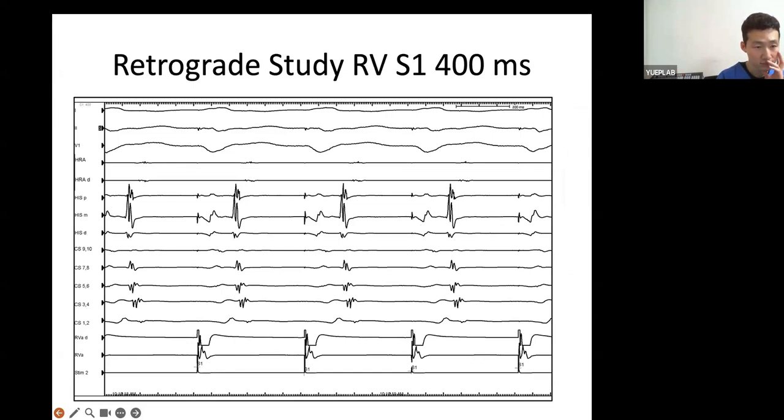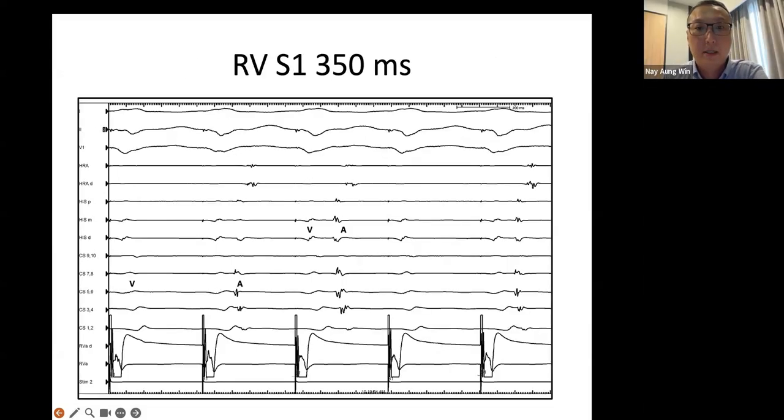So that is a septal potential, which is close to the right bundle. But luckily you had the right bundle branch block, right? What I mean is, when you pace the septum, it's going to come through the left side first, because your right bundle is blocked. Make sense? So that makes your his bundle earlier. Okay? All right, keep going.